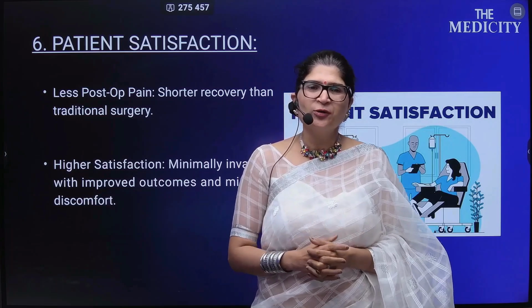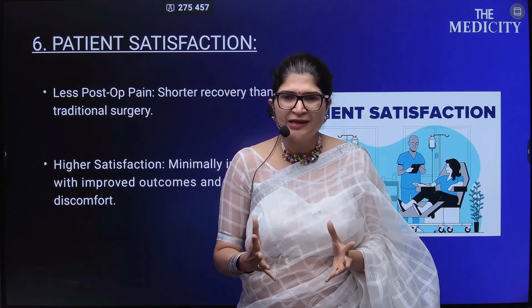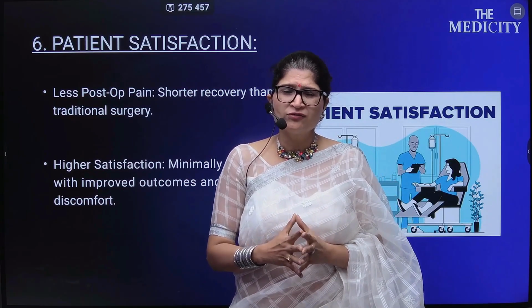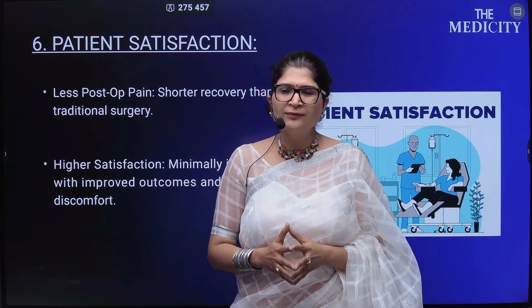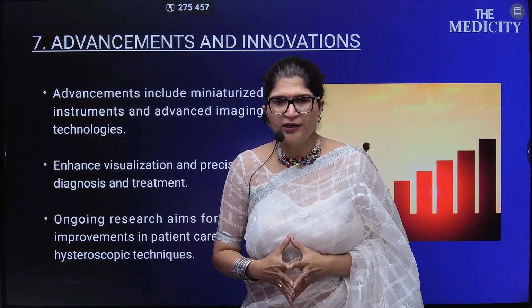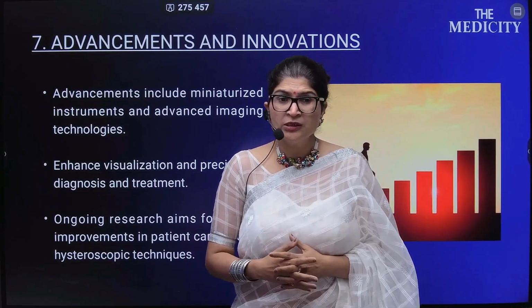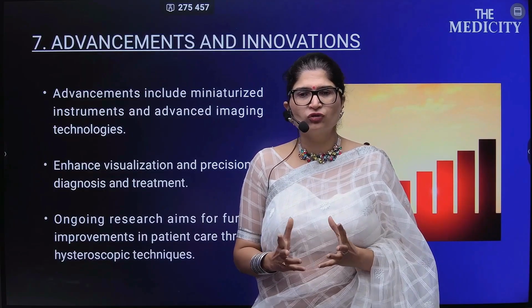Less post-operative pain and shorter recovery than traditional surgeries. The patient has a wonderful stay in the hospital, costing less to the patient and less investment for the doctors, with a higher satisfaction rate as it is minimally invasive with improved outcomes and minimal discomfort. Over time there are advancements and innovations in this technique. With the advancements, there is enhanced visualization and precision in diagnosis and treatment. Ongoing research aims for further improvement in patient care through hysteroscopic techniques.